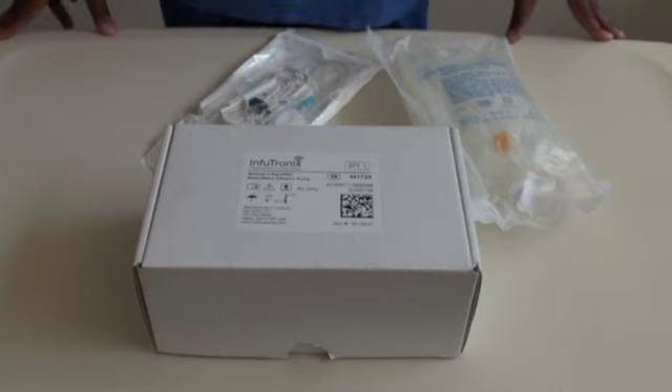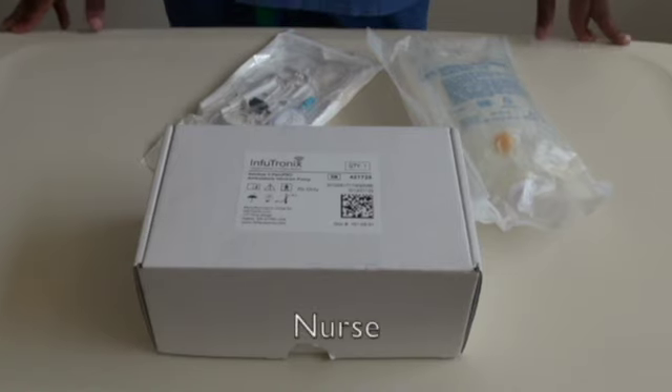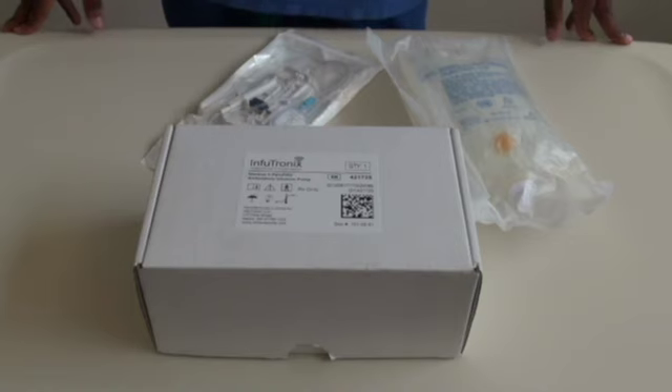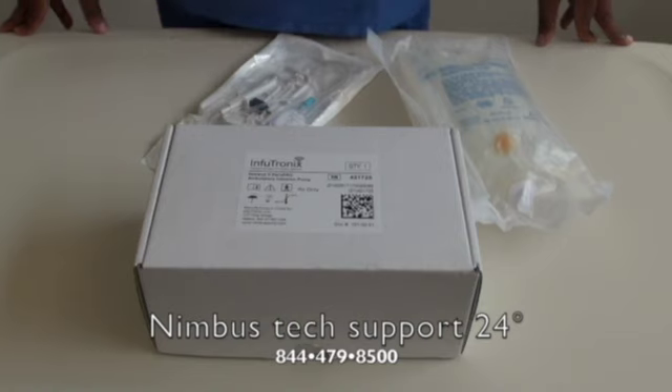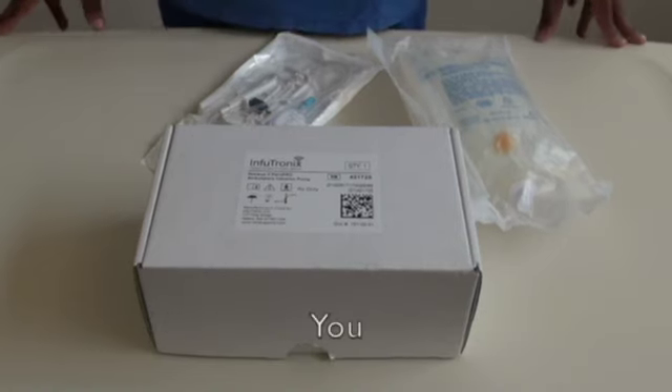There are three core team members that help with the setting up and the running of the pump. The first is the nurse, who will set up the pump, program the pump, and connect the pump to the patient. Nimbus tech support will provide 24-hour technical support, and you will be the point person for any pain control issues.